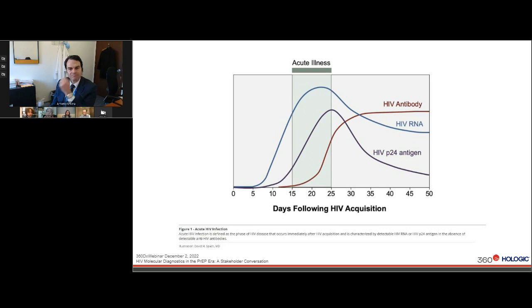But the most sensitive sample or type of testing that we have right now is detecting RNA of the HIV. And we can do this much earlier on, as early as 5 to 7 days after onset of infection, because that's when viremia starts and there's a lot of organism circulating in the plasma. And so that can be detected easily with lab-based tests. Most of the HIV RNA tests are lab-based, although there are a few that are becoming more readily available that are near a patient. But usually these have to be sent away and done sometime in the lab, with results coming back within 2 to 5 days usually.